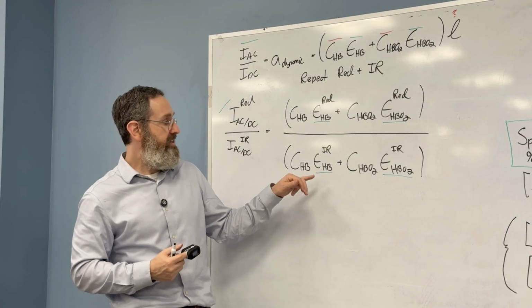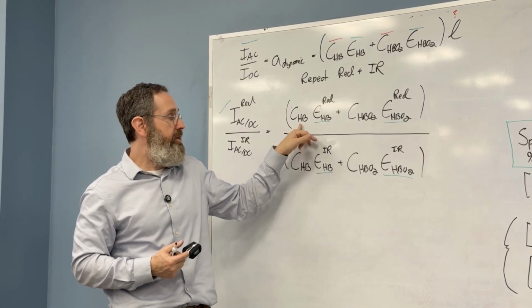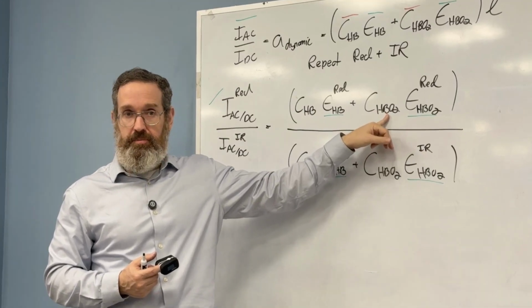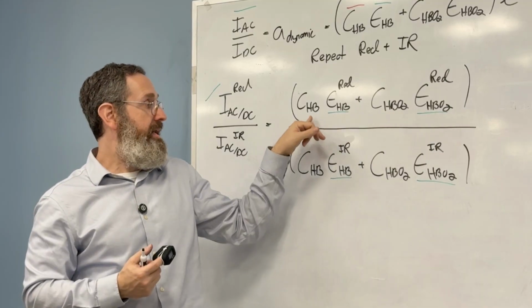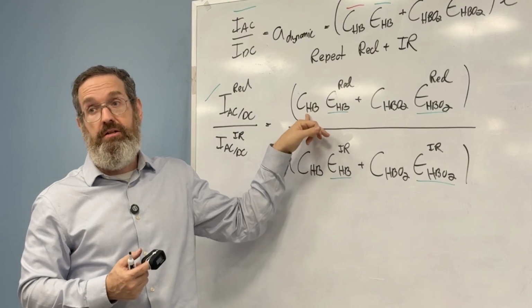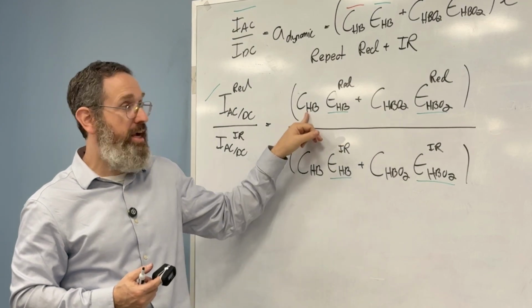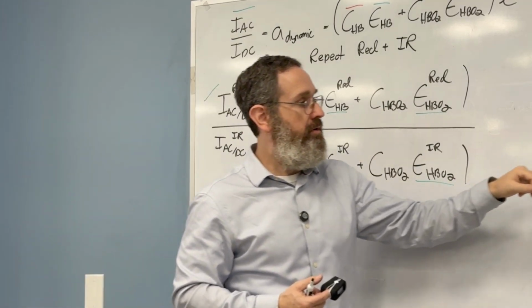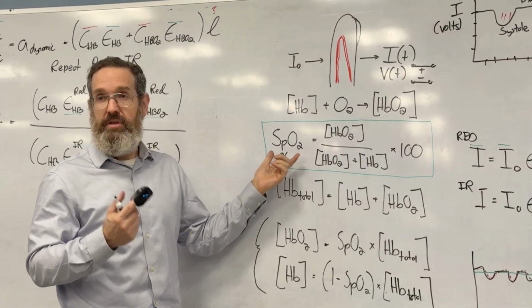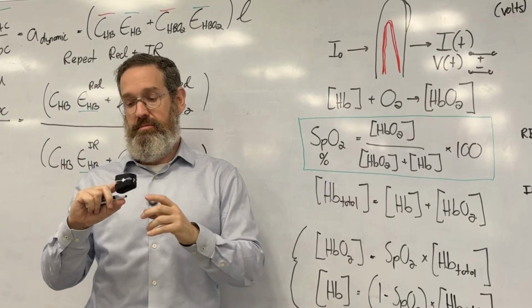The pulse oximeter cannot tell me what the concentration of oxyhemoglobin is in Emily's blood. And a pulse oximeter cannot tell me what the concentration of deoxyhemoglobin is in Emily's blood. And what I'm telling you is true. It cannot. If it cannot give me these parameters, then we're done. It can't give me the SpO2, right?